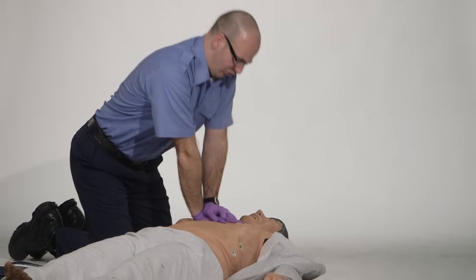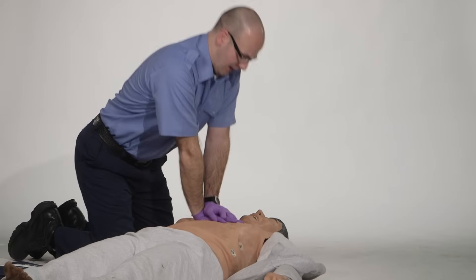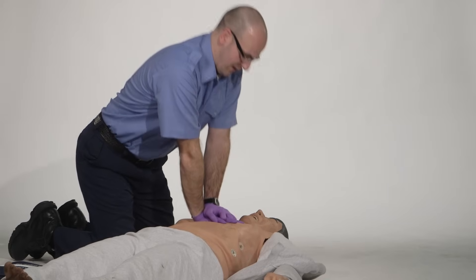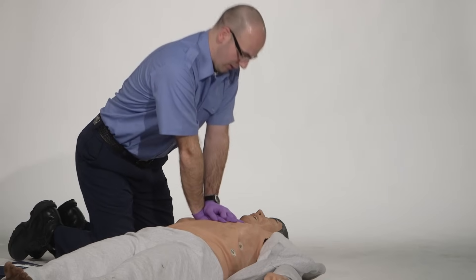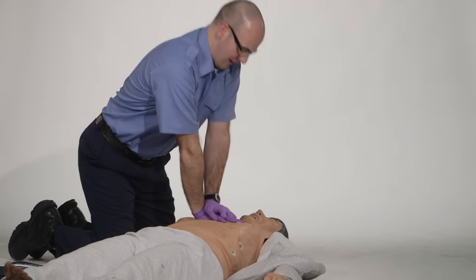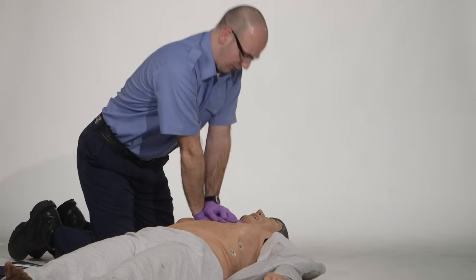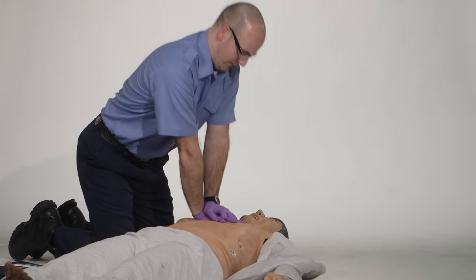I'm going to initiate CPR and I'm going to call for EMS backup. I'm going to assure that I'm doing the proper rate of CPR, that I have proper depth, and that I'm also allowing the chest to recoil.